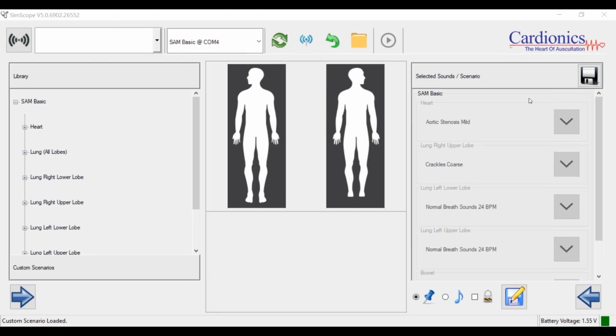So as you can see through my screen, through my laptop, that's how the software looks. Previously, you could not see anything on the stethoscope, but once you are connected, this is the window that appears for you. And I'll just walk you step by step through what you're seeing on my screen here.